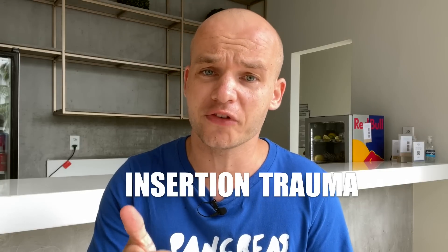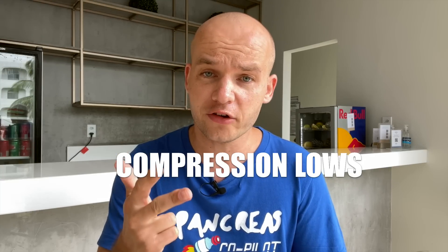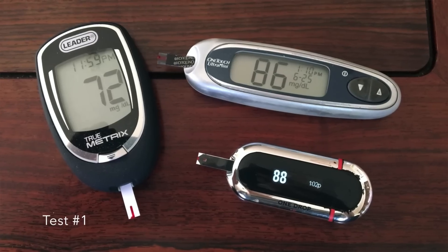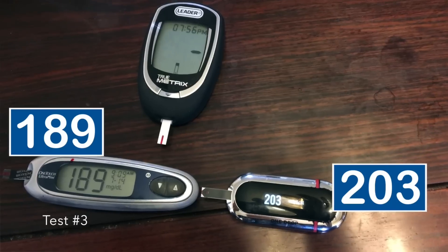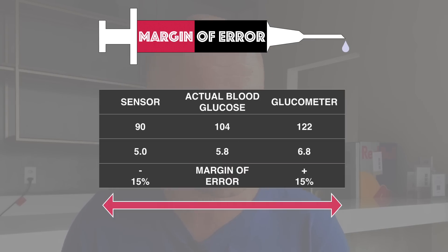There are other factors that can throw off the accuracy of your Libre readings: insertion trauma during the first several hours after sensor insertion, sudden temperature changes, compression lows where you lie on the sensor, or excessive intake of vitamin C. No measuring device is 100% accurate — both your sensor and glucometer can be up to 15–20% off the reference reading from a laboratory test. If they are both off in different directions, it can lead to quite a big difference.